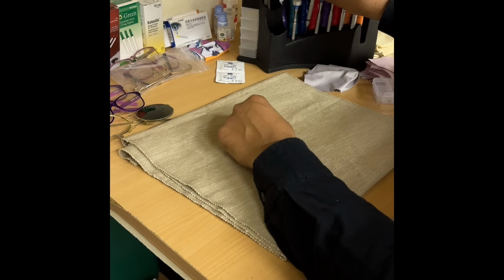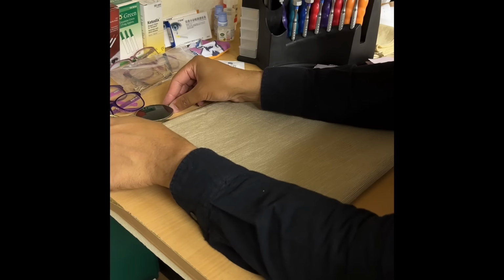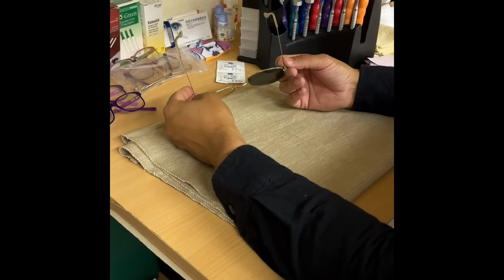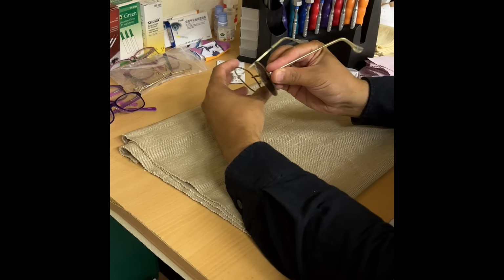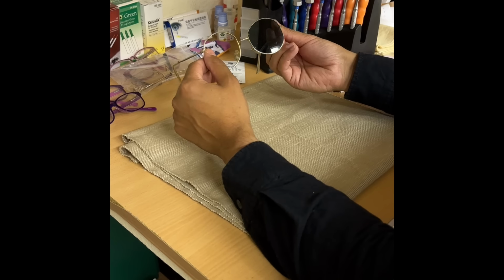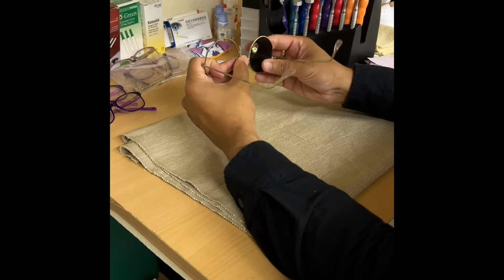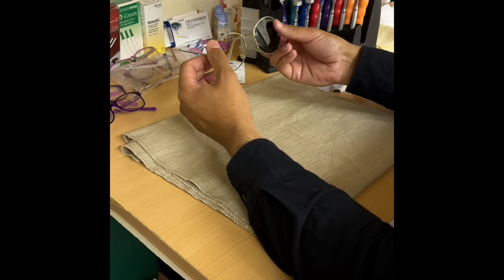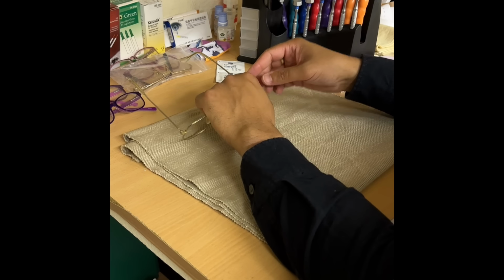You did say that this frame, you've had it many years and you admire the quality, but you sat on them, so they're in quite a state. Been bowed the wrong way, and you can see these sides are misaligned, missing a lens. I've really done some damage to these. I've done a number on them. Just bring them forward delicately. Bring them back into shape for you. I know they mean a lot to you, so be very careful.